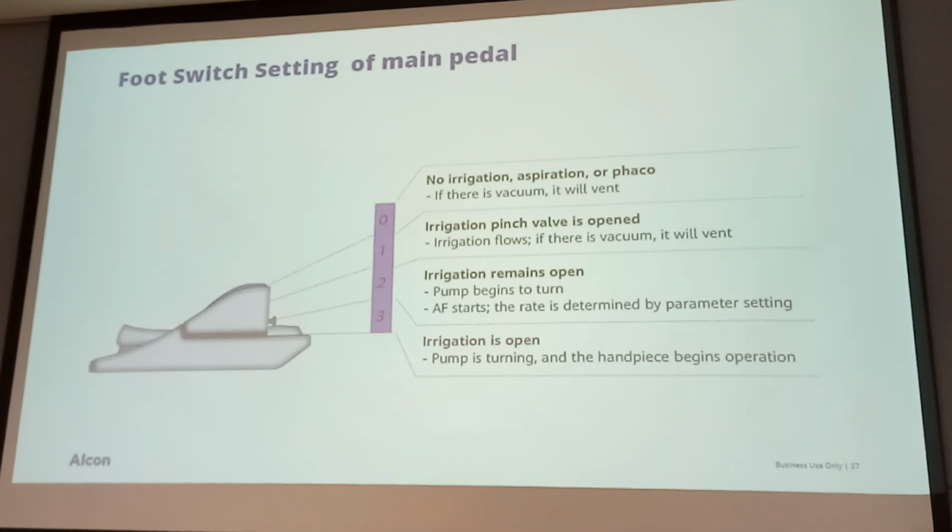So for example, if you are using the phaco chop technique, what foot position should you be in to hold the nucleus and to crack the nucleus? 3 and 2. Position 2. The end of position 2. For the new surgeon, we are always very nervous for the first several cases. It's very easy to step into position 3 and then crack the nucleus. That's what we often see. So remember, control your foot pedal well to position 2, then do the cracking movement. That's very, very important. This is what we often see in the market.